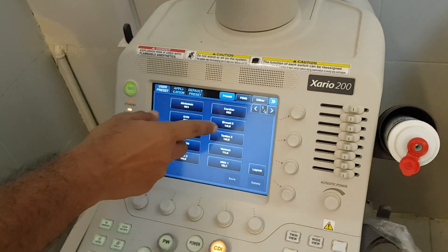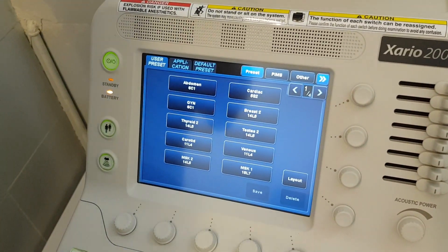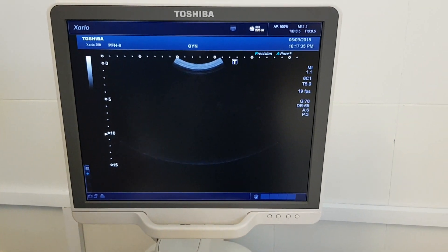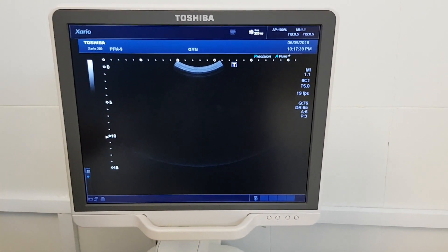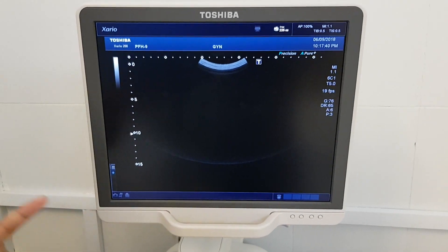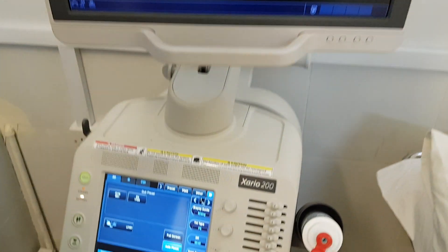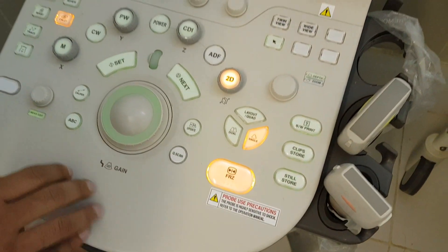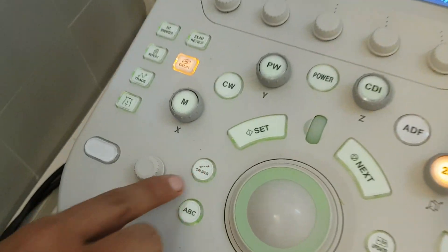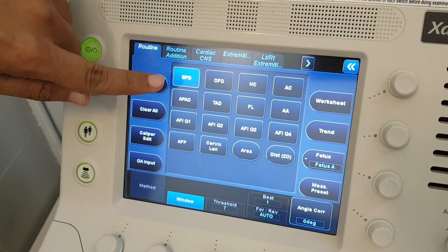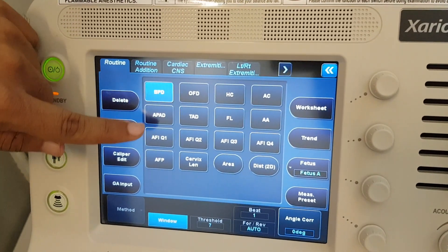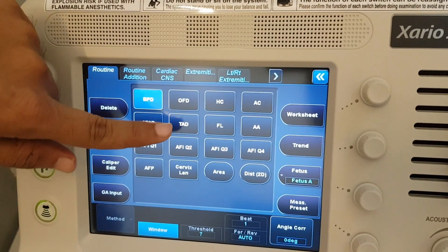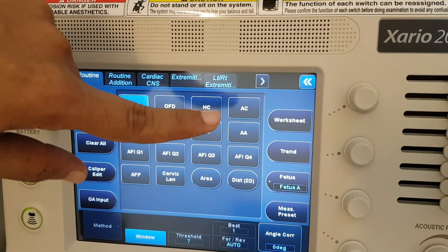Now let's suppose you select gynae from this — so here you can see 'gynae'. Why did this happen? Because gynae measurements are different from abdomen measurements. When you press the freeze button you can see on the screen that there are different measurements: BPD, OFD — all these are gynae measurements which do not come up in the abdomen preset.